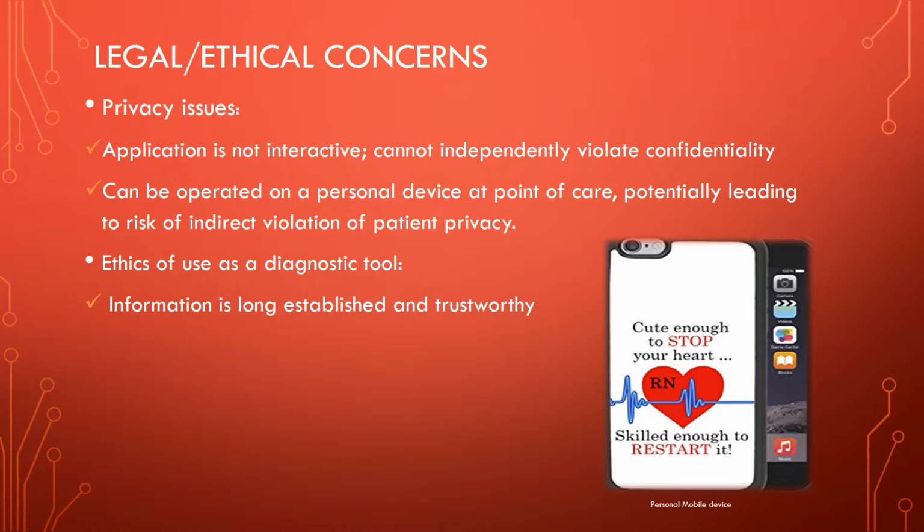Though mobile health applications provide convenience and efficiency to healthcare workers when caring for patients, there are many legal and ethical risks, including disclosure of protected health information. Applications in which information can be entered pose the risk of unintentional sharing of health information through collection by third parties. Aside from potentially using a personal device while active at the bedside, I do not see any legal, ethical, or privacy issues with the ECG interpretation application.